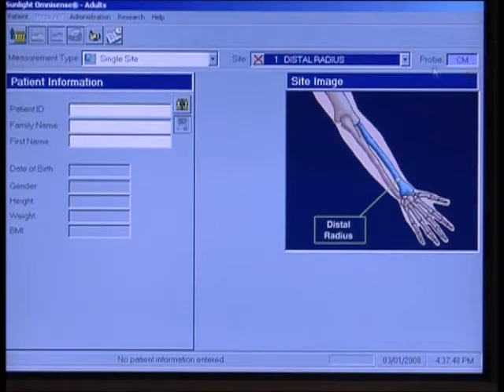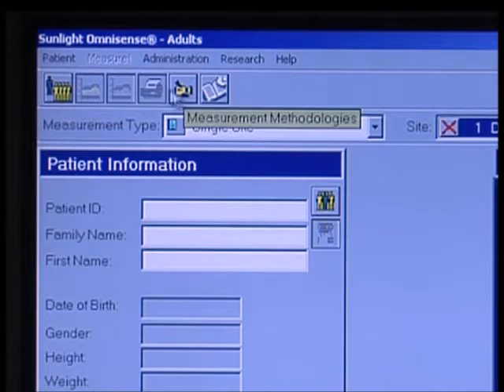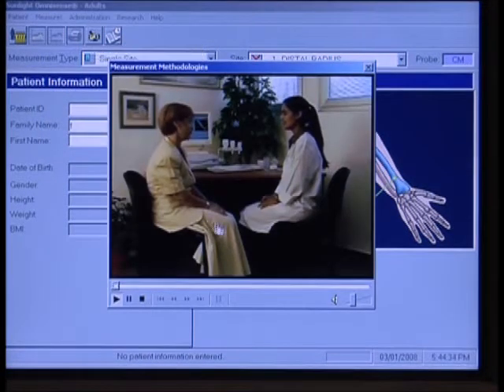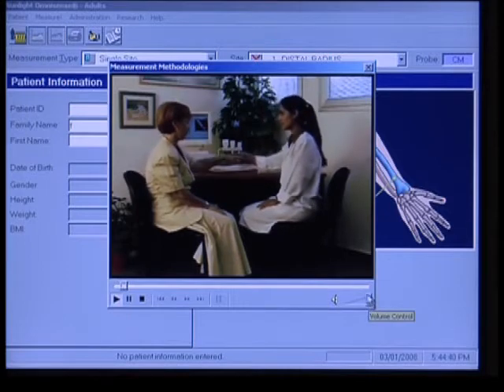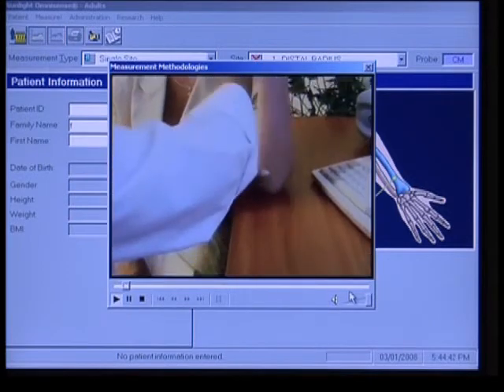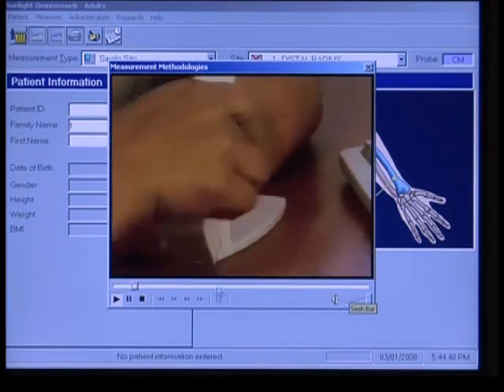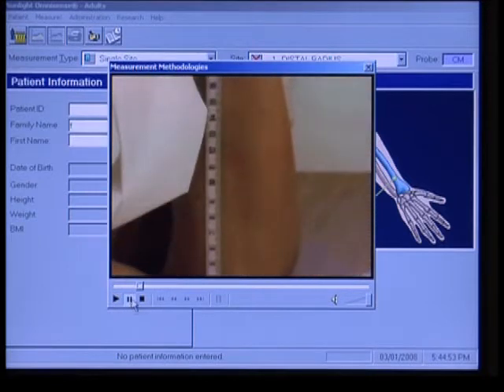You'll see some icons up top here and we'll talk about those as we move along. Here is an important one: new patient measurement. And here we have measurement methodologies — those are actually videos that you can watch ahead of time to make sure that you have the technique correct. The patient should be positioned opposite the operator and next to a standard desk. Use the measurement gauge to determine the position, and place the subject's non-dominant arm on the gauge platform. The elbow should be positioned so that the arm is perpendicular to the platform.